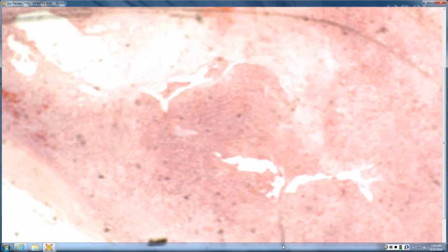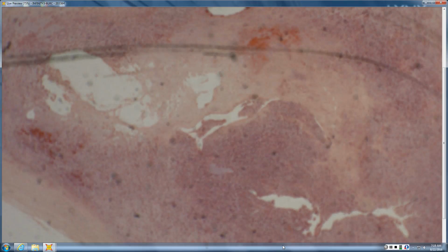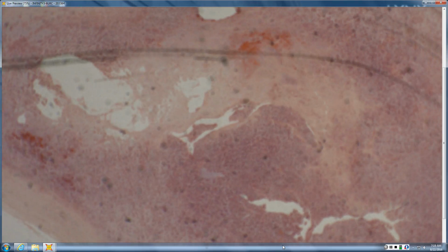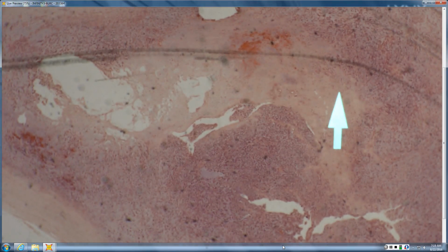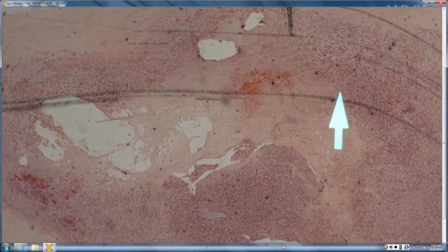Okay, so 19. This one is a mixed tumor gone bad, and it can be hard to determine that. It's certainly a deeper proliferation, and it just has this central zone of horrible, nasty necrosis. And since we're running short on time, I'm not going to go deep and do like a mitosis hunt, but I will tell you that there's really not much in there, and that's another reason why I'm not going to do the hunt.